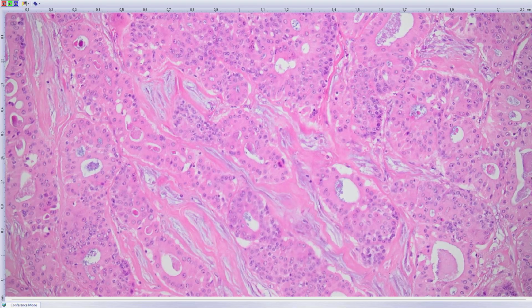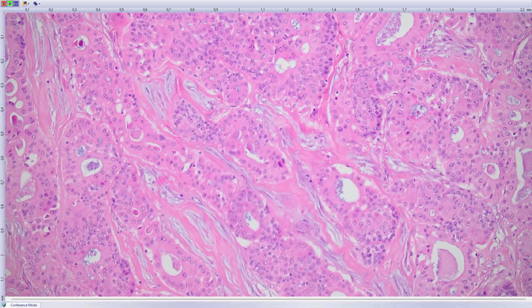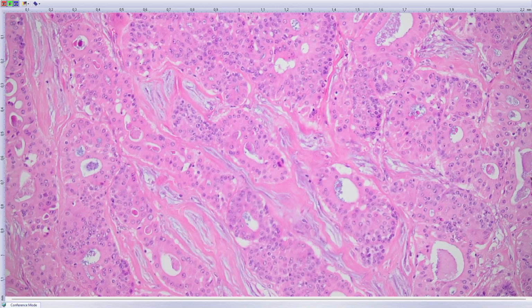Well, SOX10 negative, S100 protein negative, and if you want to start to think as the referring pathologist about salivary duct carcinoma, androgen receptor negative. I don't have the immunos with me, but there was staining positive in the abluminal layer, or a little irregular, for P63 and P40.